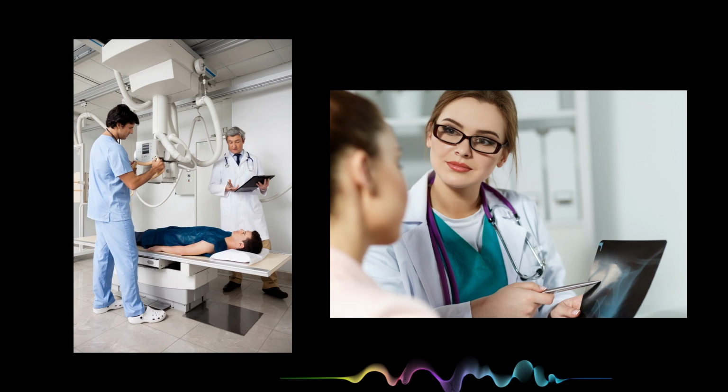The last thing to do is to send the images to the radiologist for review and to excuse your patient. You did it. You made it through an abdominal x-ray. Great work.